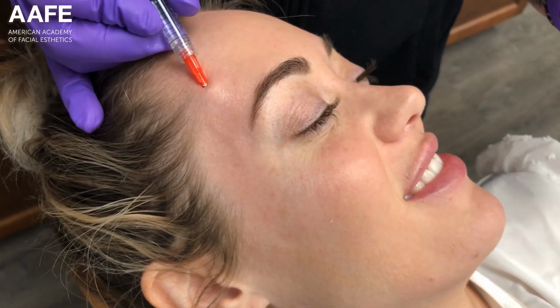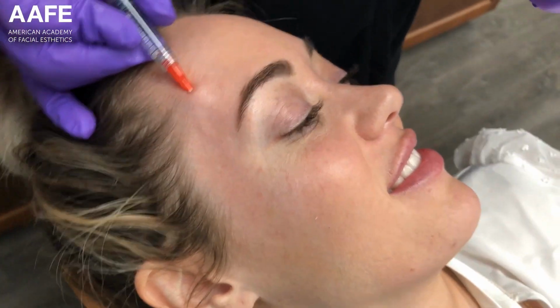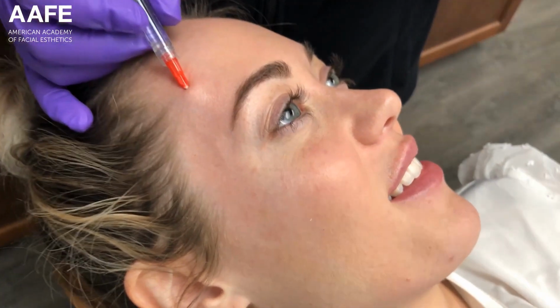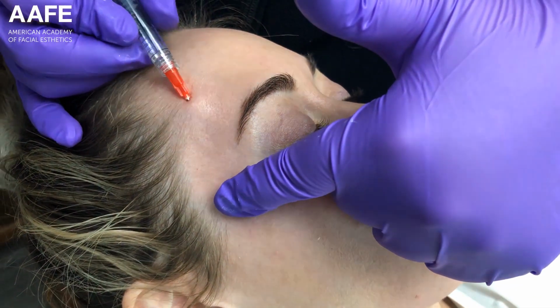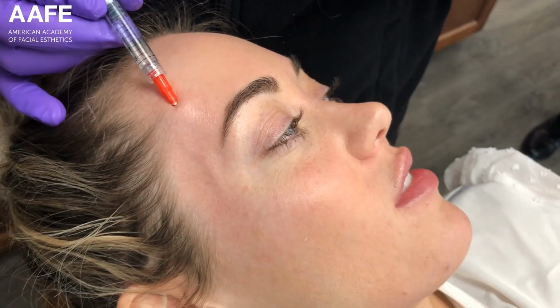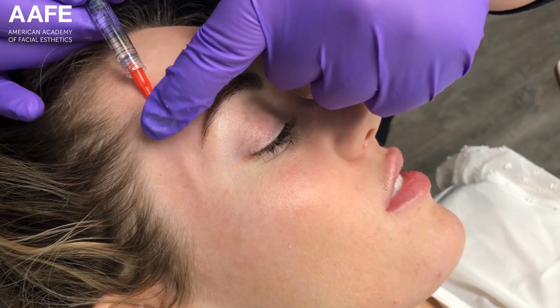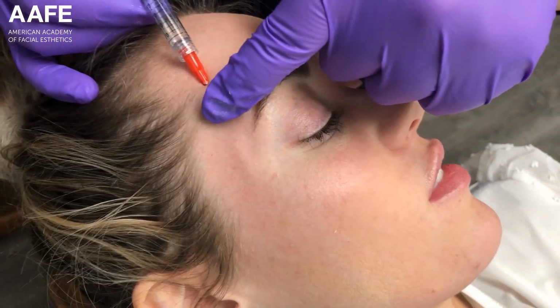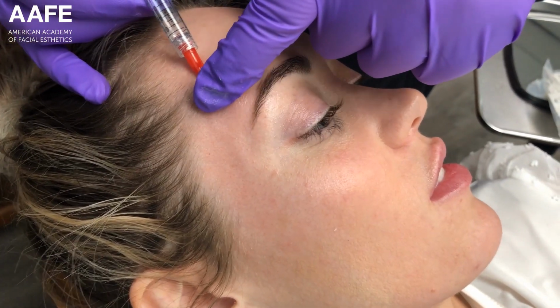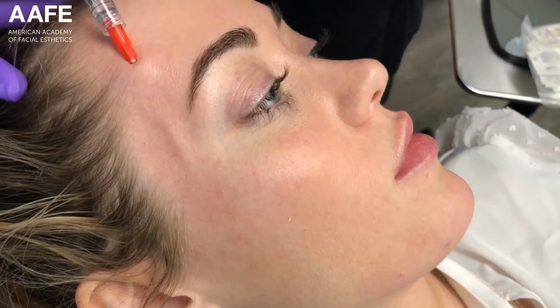In ultrasound, we anatomy mapped this patient beforehand, so we knew what the anatomy of the temple looked like. It's like having an x-ray of the soft tissue. It's amazing, and the Wave FE is an amazingly powerful, small, handheld, cordless ultrasound imaging, and you can see. How do I know that I'm not anywhere near the superficial temporal artery? I don't, unless I really get an ultrasound in there. I can feel in there and get an idea what plane I'm in, but I want to be underneath that superficial temporal artery, and the top-down approach here is one of the safest approaches.